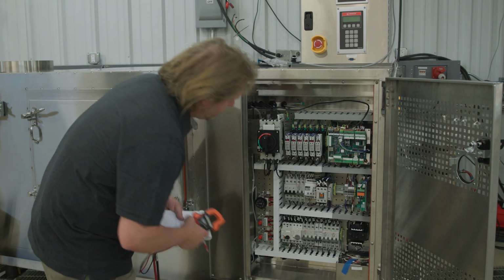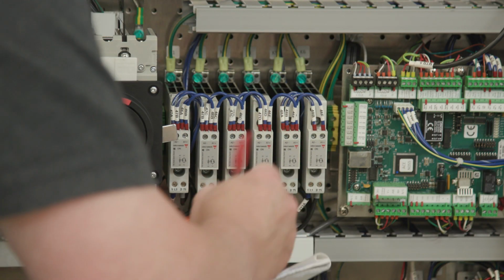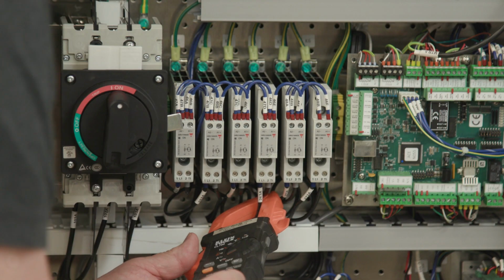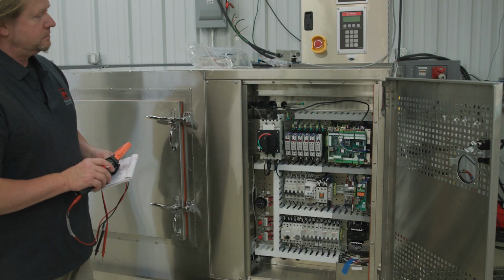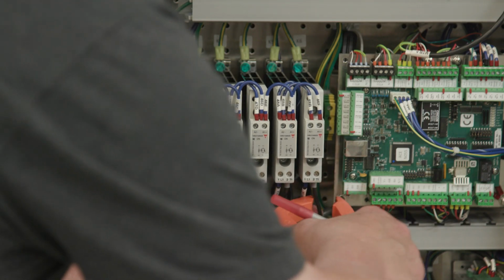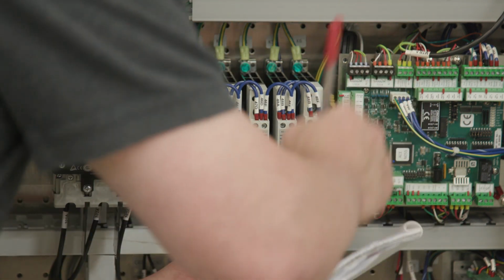Water heater amps. Again, using a multimeter, check and record the water heater current. This time, the reading should be 0. Again, using a multimeter, check and record the water heater current. This time, the reading should be 0.